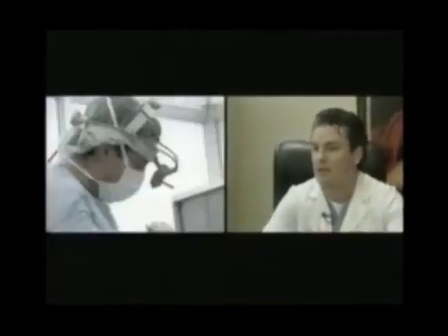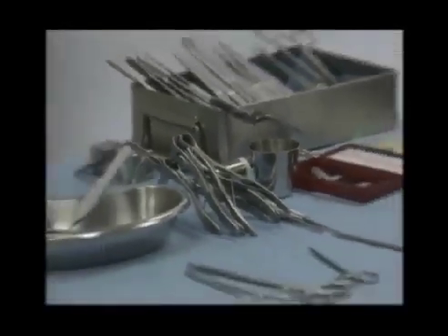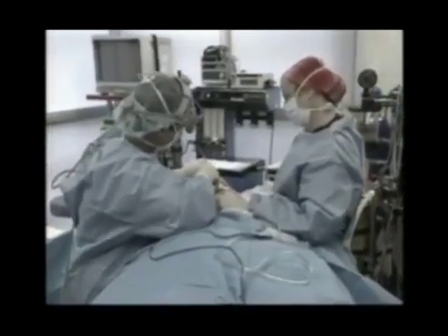And so what we'll be doing is shaving down and chiseling, much like sculpting, the bridge of her nose. Now the trick is, of course, to leave it still looking narrow and natural and not over-reduced, because that 1970s ski jump appearing bridge is just not very popular right now. And her stated goals, Shannon's goals, are to look natural.